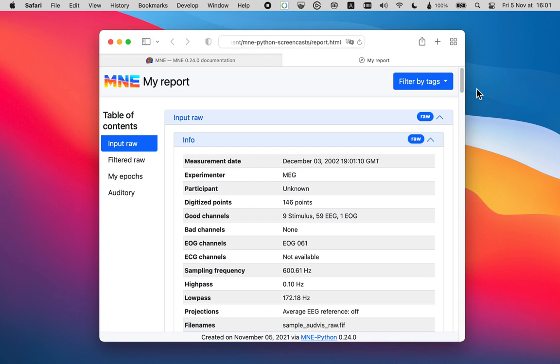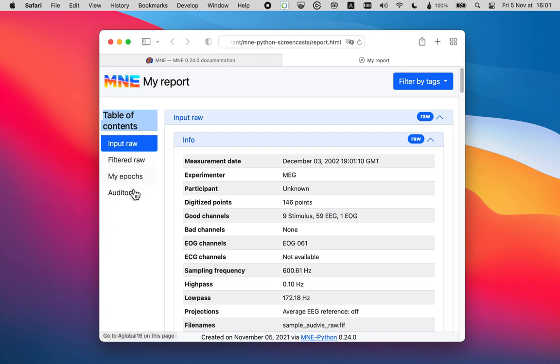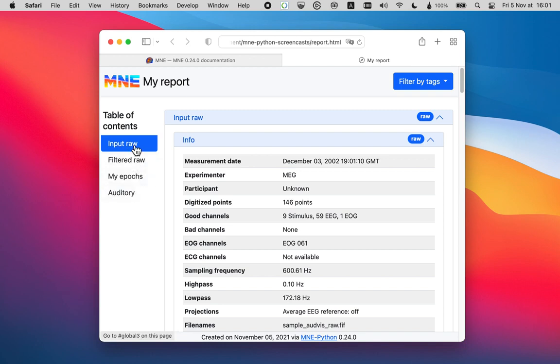As you can see, it opened the generated report in my default browser automatically. And if we take a look at the table of contents here on the left, we can see that all the content is present in the exact order that I added it to the report.